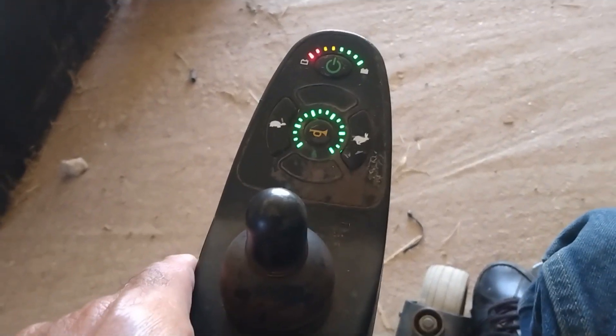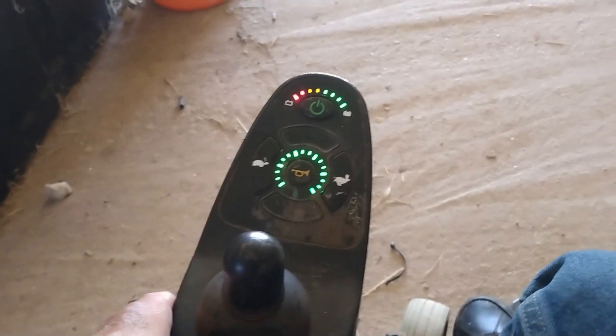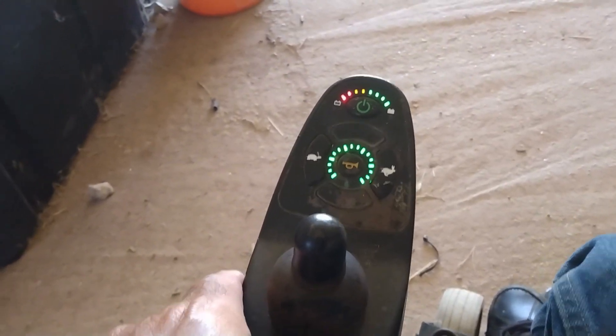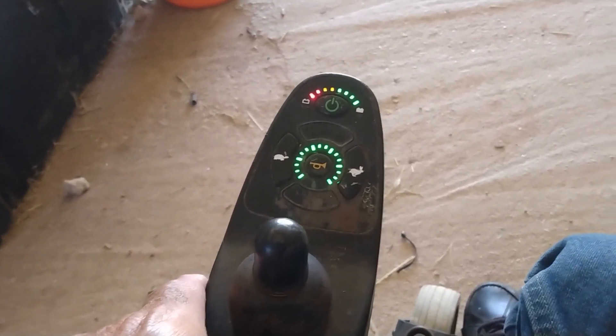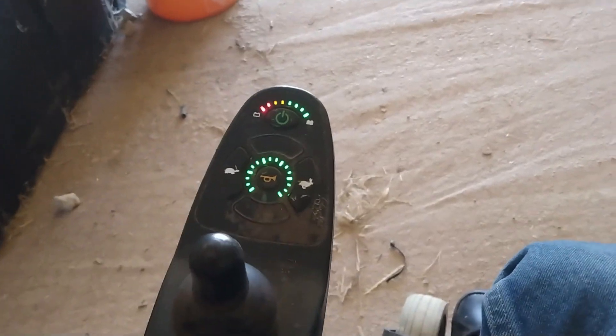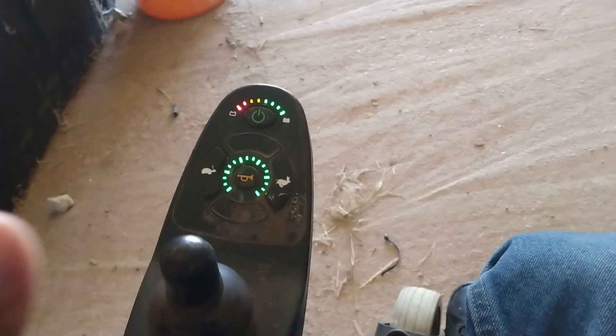I have a tip for troubleshooting for the Jazzy 614. I don't know if it will work with other chairs or not, but my chair stopped working suddenly and would not move at all.